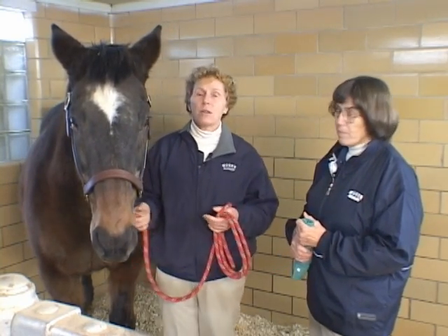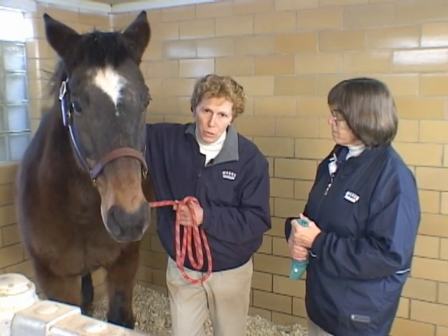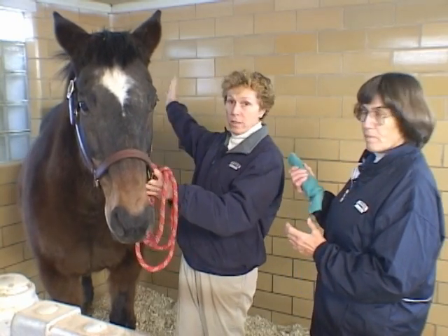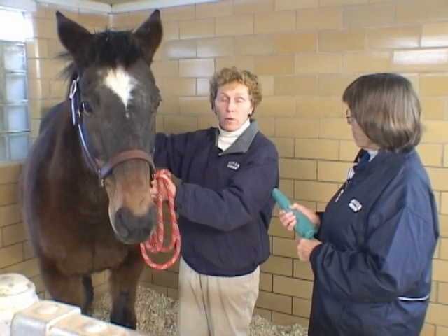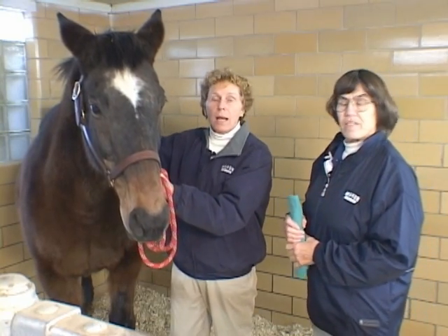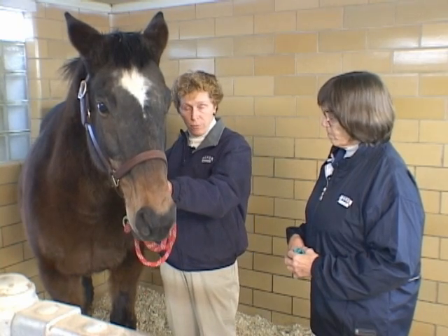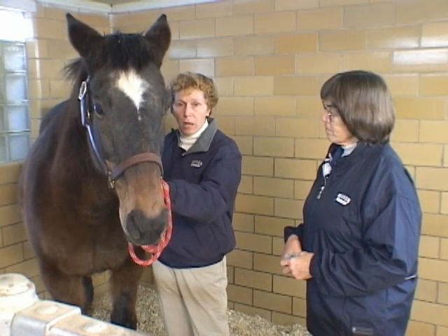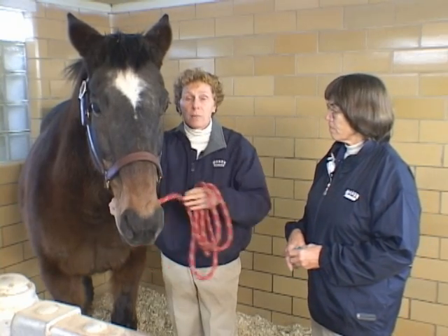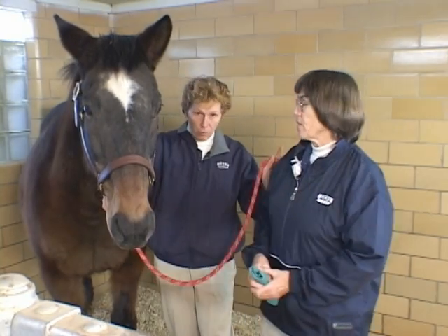The kinds of things a horse is going to do to evade being tubed — frequently they'll back up. The fact that Leroy's got his rear end towards the corner is not an accident; we've put him this way on purpose. Of course they can also strike, so you want to position yourself beside them, not in front of them. As the tech, you want to position yourself so that you're beside them and not pushing the veterinarian directly in front of them — you've got to give them space to work.